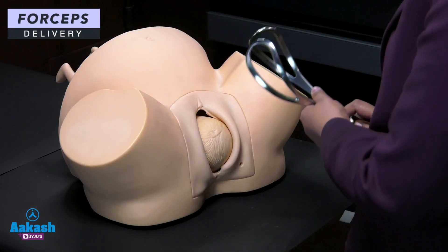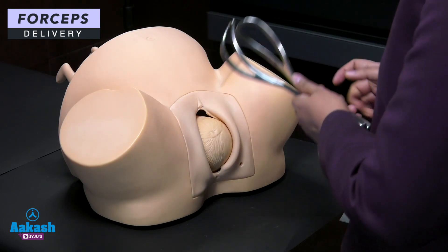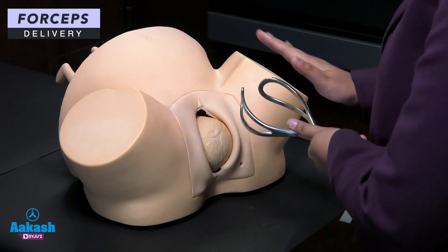We have seen the parts of the forcep. Now we will see how it is applied on a female pelvis. First of all, you have to identify the right and the left blade.